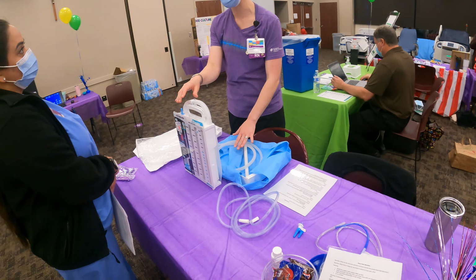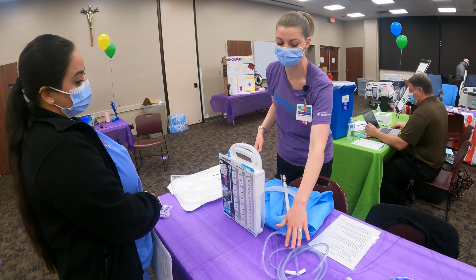They have no restrictions as far as that's concerned. But when they're hooked up to suction, they're limited to the space that this allows them to go.